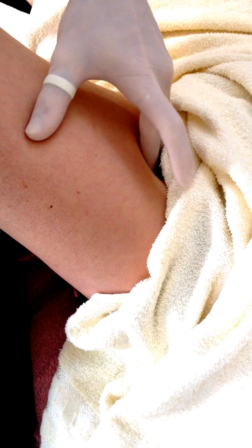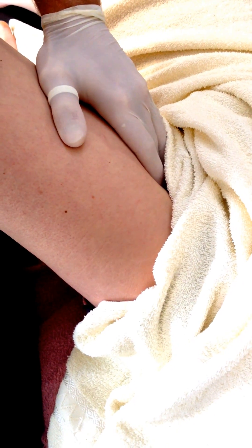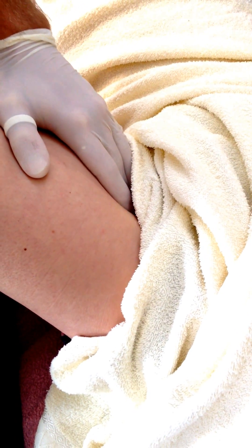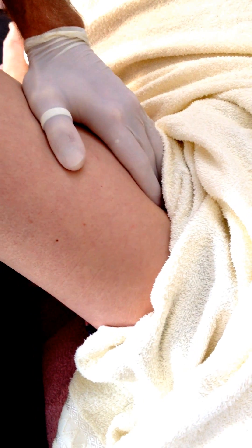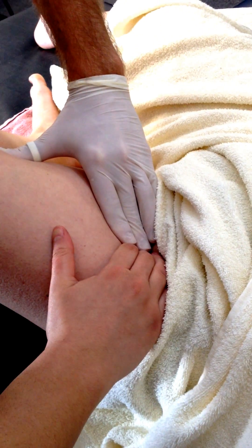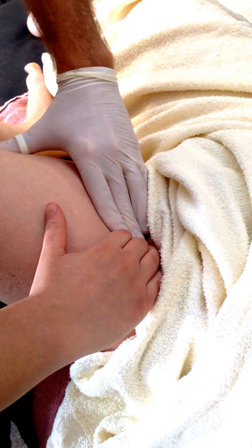I'm palpating down there, and my direction of palpation is almost sort of lateral, to try and come in onto that lesser trochanter of the femur, which is where the psoas attaches. So just gently lift your knee towards you — and I can feel that tendon coming up under my finger. Go again. Good. Now lift up — feel that come up. So it's a distinct tendon that pops up.